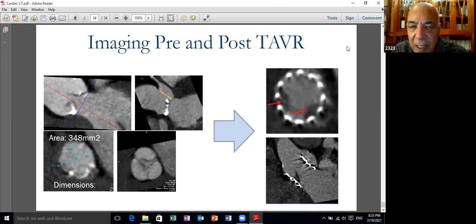So the term high attenuation means you attenuate the X-ray, it does not penetrate, and it appears white. Low attenuation means the signal is weak and there is no strong attenuation, and therefore the picture will appear gray. So that's the difference between high attenuation and low attenuation. This is a vocabulary which is used by radiologists.